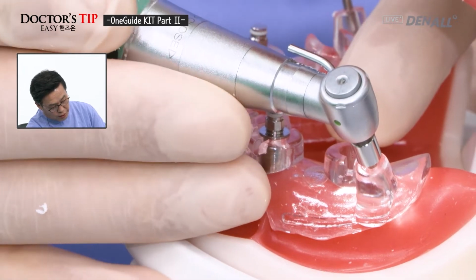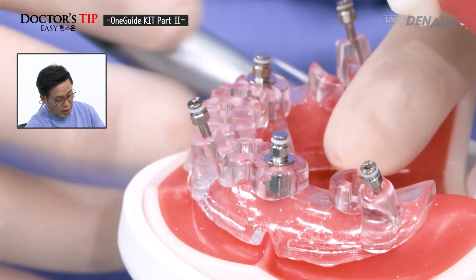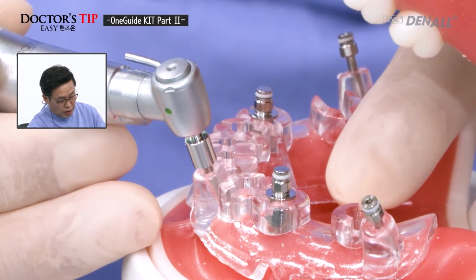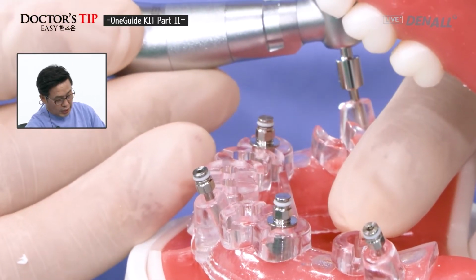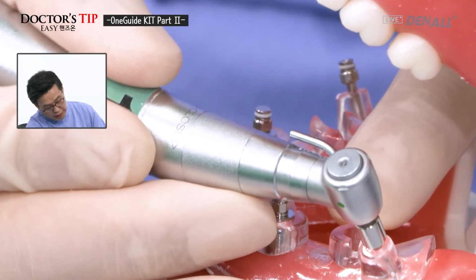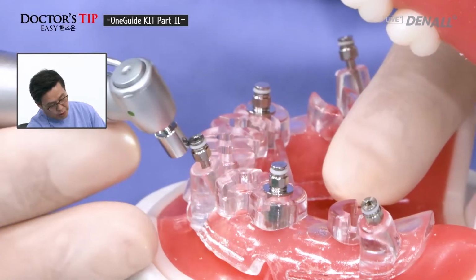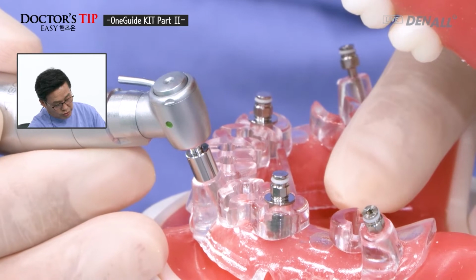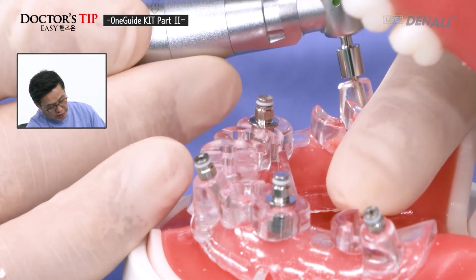Placement mode, everything is connected. There are 2 vertical anchors in number 4 and 3 lateral anchors have been consecutively connected so that you don't tighten one side first, but you do it in turn. As we connect anchor screw, we can prevent deviation of template and accurately connect it in the wanted area. Now there's balance. Anchor screw is going to be tightly fixed.